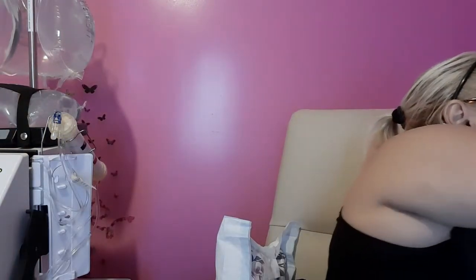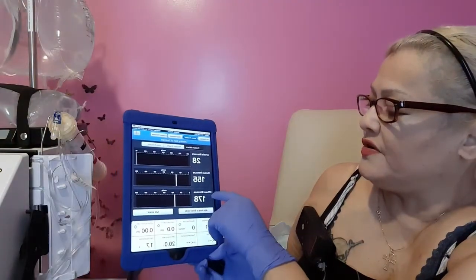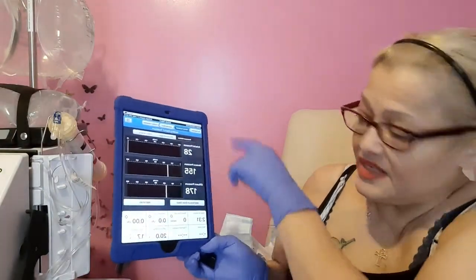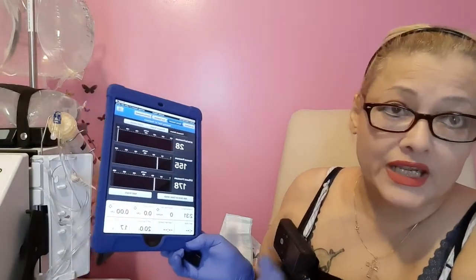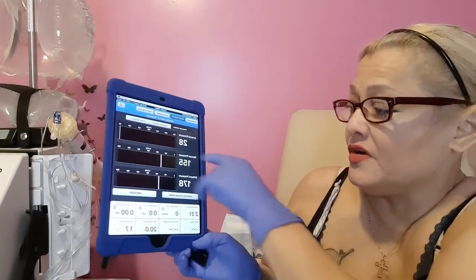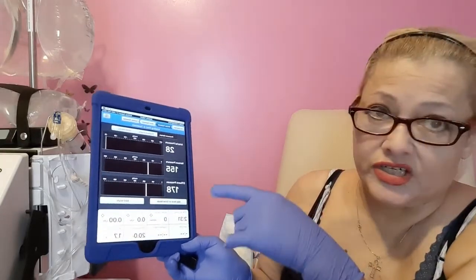Okay, let me show you guys. So here's the iPad. See those numbers? This is the arterial pressure, venous pressure, and effluent pressure. Nothing's happening because I'm not connected yet. Once it starts happening, once I get connected, these numbers are going to read the pressure of my blood going through. And then I just adjust it.